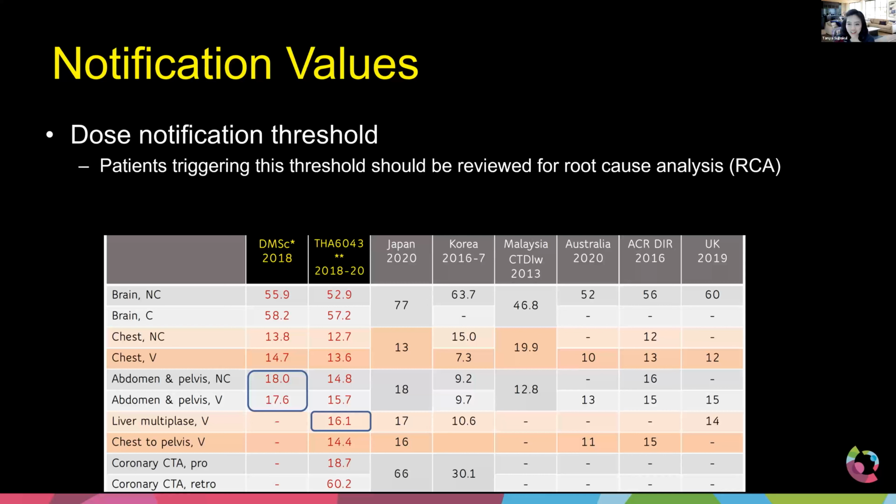You know what we are talking about because you show the slides that we have the data. I think I'm learning Thai, but I probably just heard DRL. So that's good. So Dr. Parithai just mentioned that we probably have a very small sample size, which means it's probably not the real national DRL, but maybe a local DRL, but it's a good step to start.